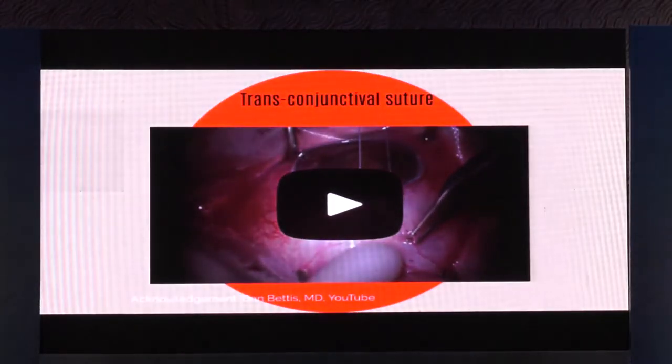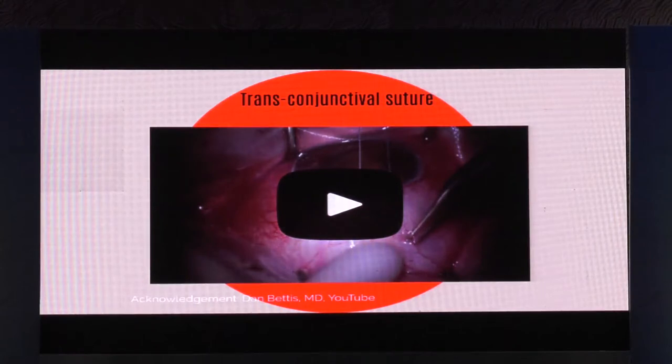Transconjunctival. Oh, this is one thing I would like to talk about. I did this, but I don't have a video of my own. I had to acknowledge YouTube for this, really. And I learned this technique when I was in the US, wherein it's a much quicker way to sort out bleb dysesthesia or even hypotony, wherein we do a transconjunctival suturing of the flap.